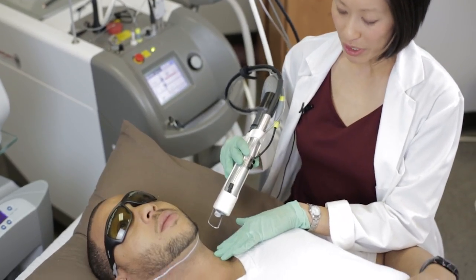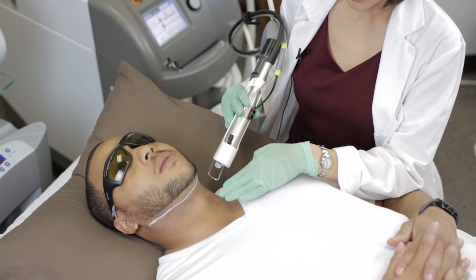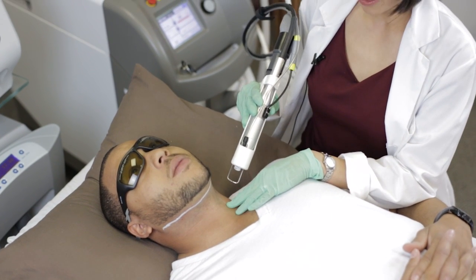As we do the treatment, I'm going to cover the entire surface area of the skin that we want to treat. A little bit of overlapping is okay, but generally speaking, overlapping is not necessary.